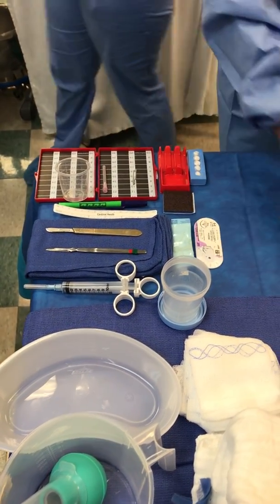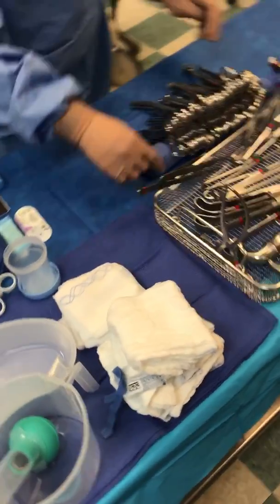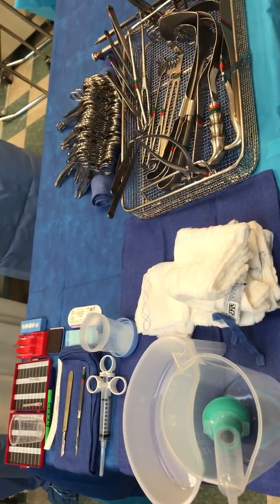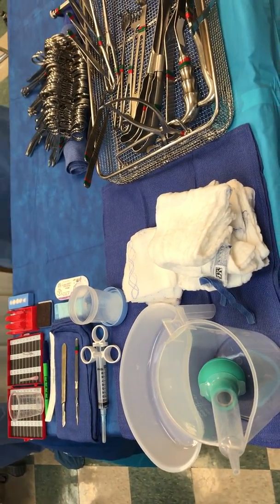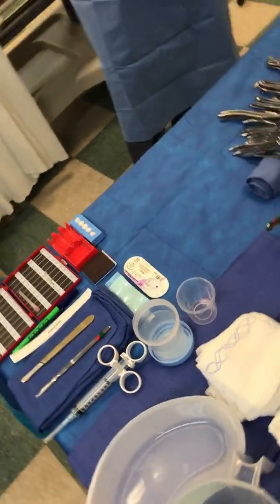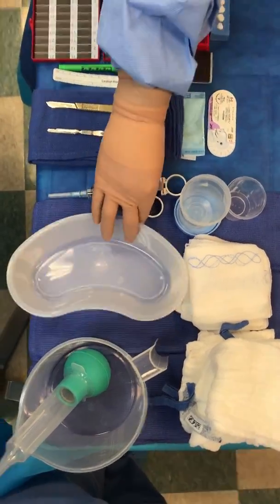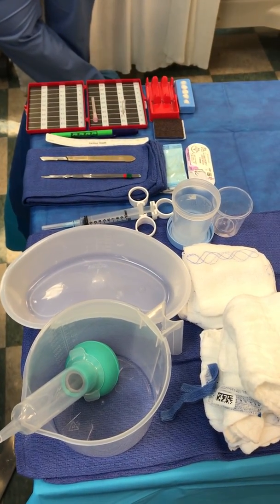But what I want you guys to get from this is don't move your things around. Don't touch anything until you're ready to put it where it goes. And that's it. This is exactly the setup I want you guys to have. I don't want you guys to do anything else other than this. Doesn't matter what tray it is. I want this towel here. I want this here. I want this here. I want this here. I want this like this. Okay?